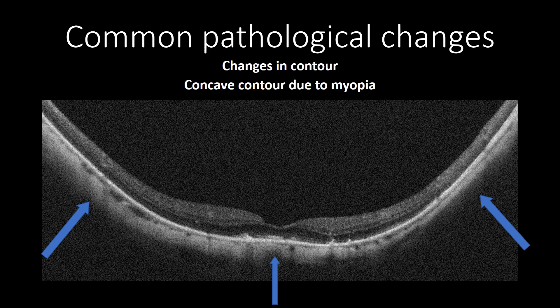Please note the poor quality of this OCT scan, as it was captured by a spectral domain OCT machine, which usually struggles to produce high-quality scans for high myopic patients due to the beam laser wavelength being between 800 and 900 nanometers. In comparison, swept-source OCT produces better quality scans in high myopic patients, as its beam laser is around 1000 nanometers.